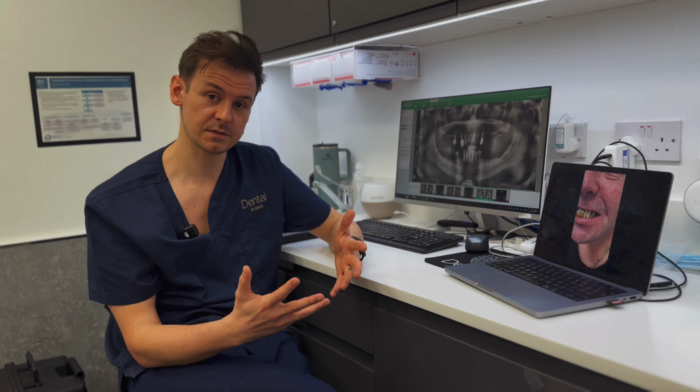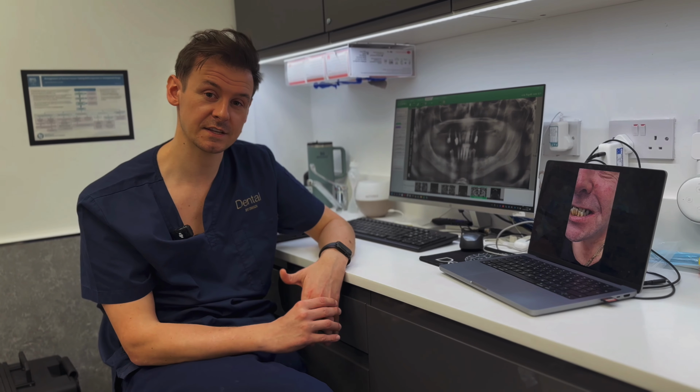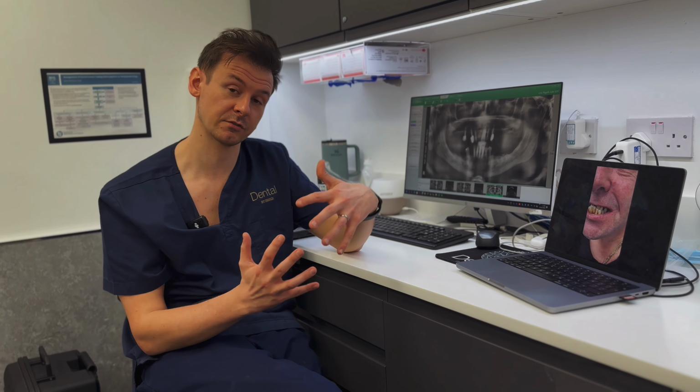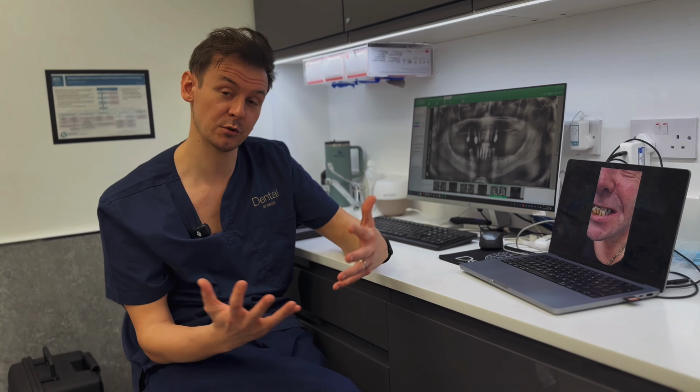And then we took our records, we took our photogrammetry scans from iMetric. We sent that to our designer and our designer was able to design a new set of teeth. Ultimately, we managed to reverse his underbite and give him a normal, nice, beautiful smile, which we actually 3D printed on the day.